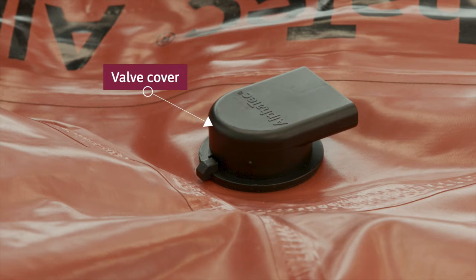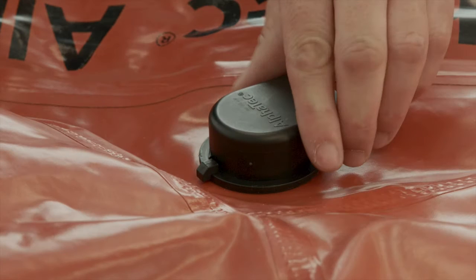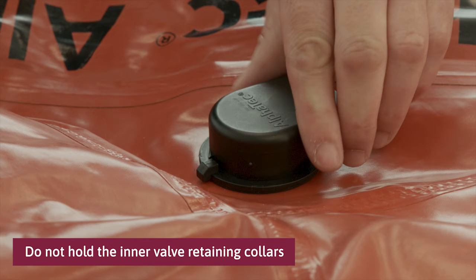First, remove the valve cover on the outside of the suit. Do not hold the inner valve retaining collars when removing the valve cover, as this may cause the valve to loosen from the suit.